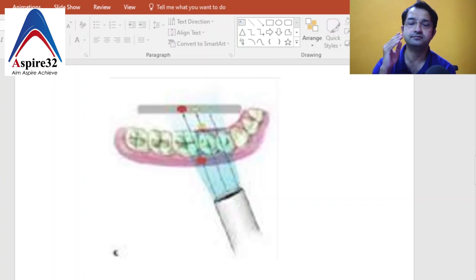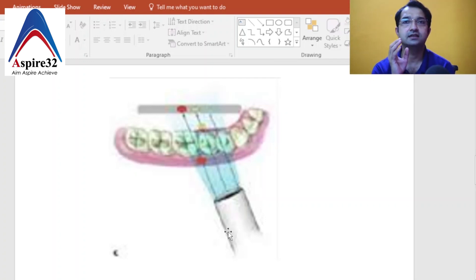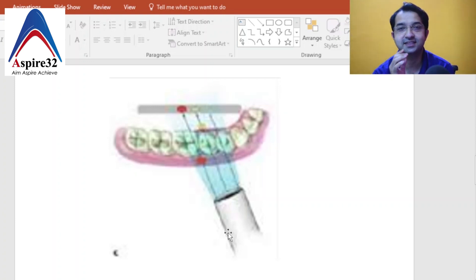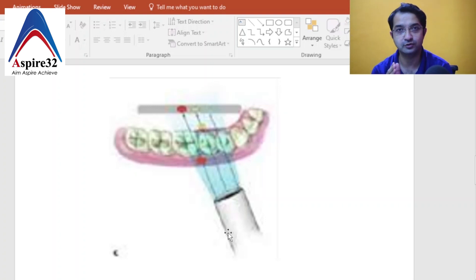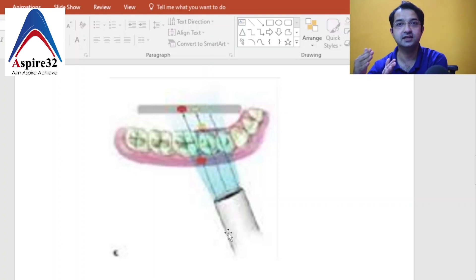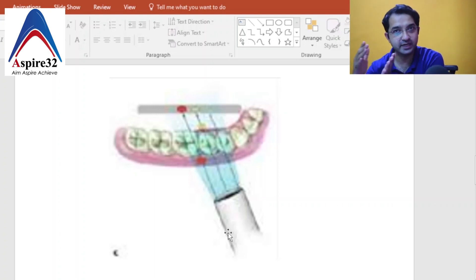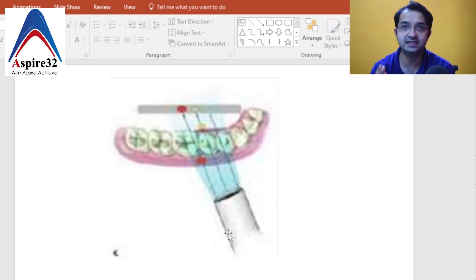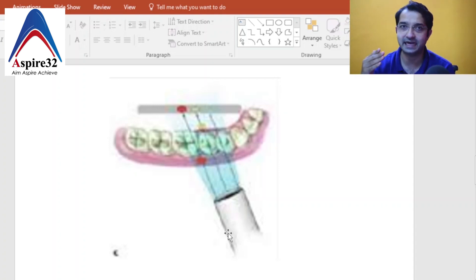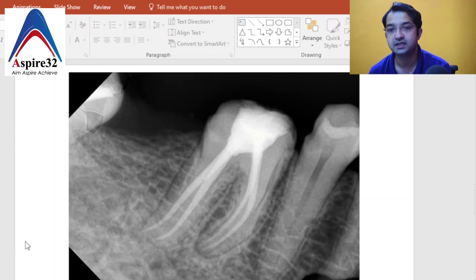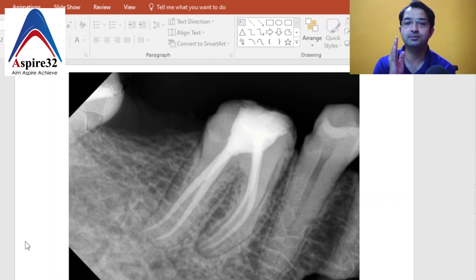Here is a very important point: when we give mesial angulation, we are moving the head of the X-ray unit to the mesial side, but the rays are actually directed towards the distal side. So whenever people say 'give mesial angulation,' what they mean is move the head mesially — and the rays are directed distally. As you can clearly see in this image, when you do that, the mesial canals get separated.